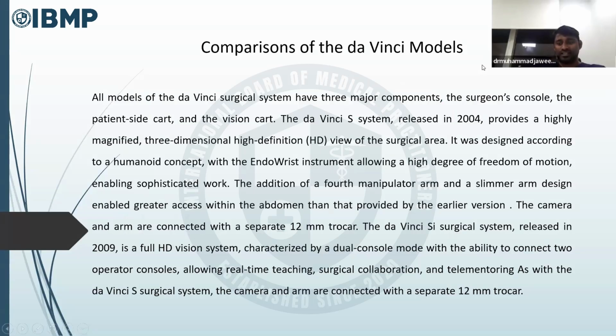Fine. So today we are discussing the comparison of the Da Vinci models and SSI Mantra. This is a modern era of robotics. Already in the first 2-3 classes, we were discussing robotics, its importance, advantages, how to operate it, how to dock it, and the applications of robotics. Now, compared to the modern era, that is right now in 2022, 2023, 2024, 2025, these are called the modern era of robotics.